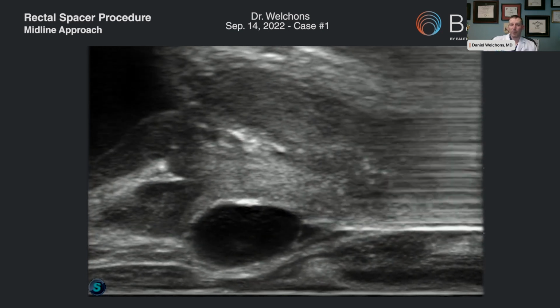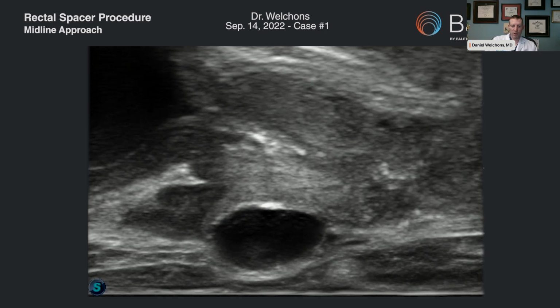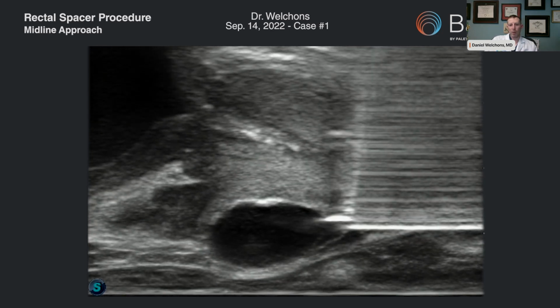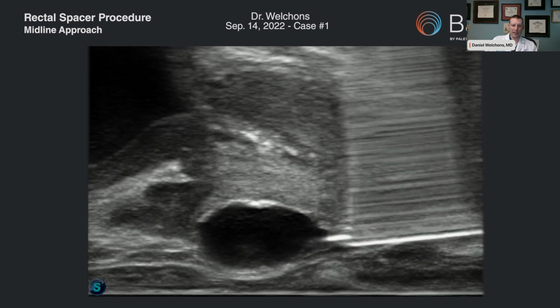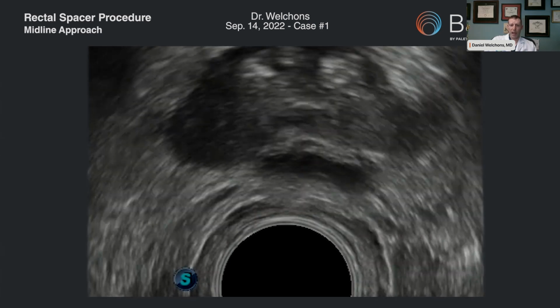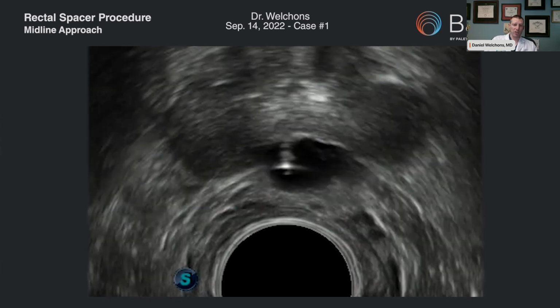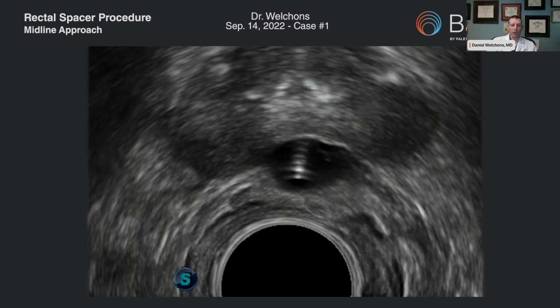It's not uncommon right here at the mid part of the prostate to see some fibrosis or some scarring. This is often the place where the biopsies have been taken from a transrectal approach. And so it's not uncommon to maybe not get the separation that is seen at the base of the prostate. And that's okay, because then you just switch back to your axial view. You can already see that at the base there's a great space that was made. And then you move backwards towards the apex, you can see the needle. And when you see that tip of the needle, you can decide what you need to do.